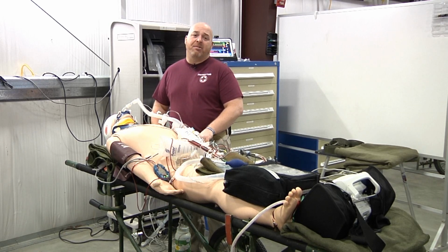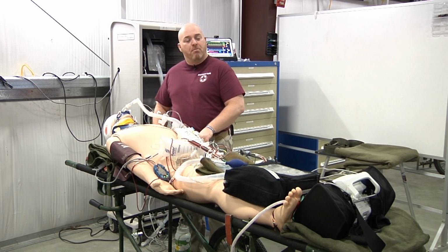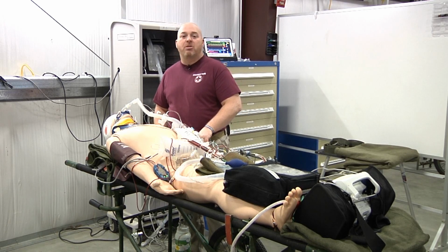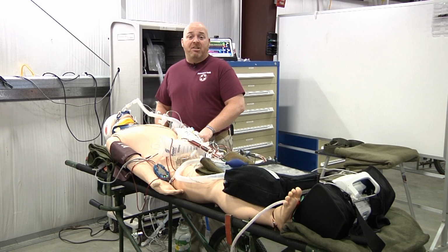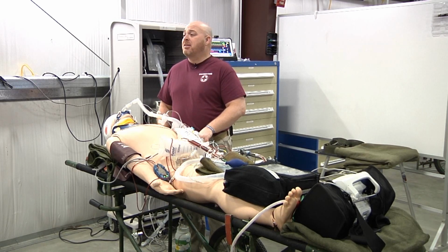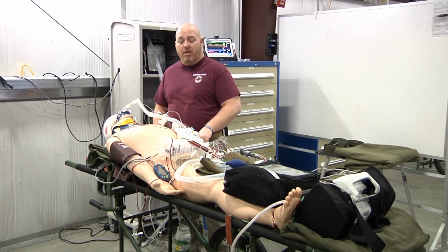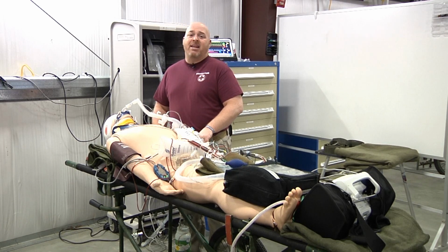If your patient is on 90% FiO2 and you know that you have a long transport time and only 3 or 4 bottles, maybe you can consider dropping your FiO2 down to 60%. Ask the doc, what SpO2 would you like the patient to remain at during the duration of your flight? If your patient has a head injury, maybe you need to consider a good baseline MAP. The SMOG says the MAP should be greater than 80 or systolic blood pressure higher than 110. So maybe you want to shoot for a MAP of 85.